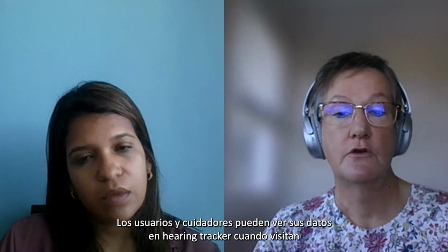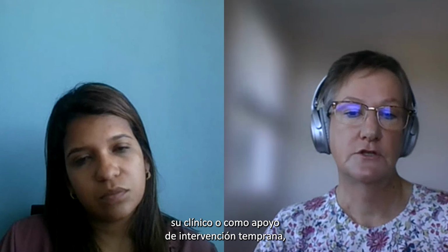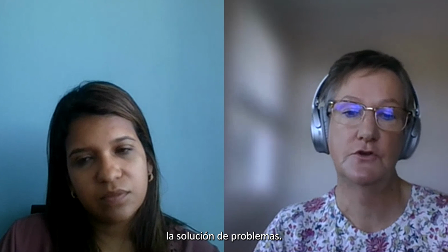Recipients and carers can show their Hearing Tracker data when they visit their clinic or early intervention support, which assists greatly in counselling, support and troubleshooting.